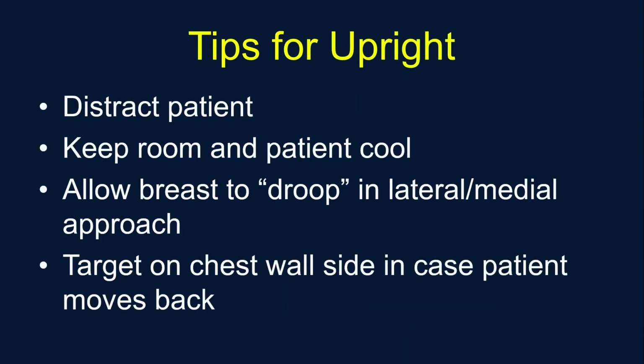Tips for the upright: the most important thing I've found is to distract the patient. Keep them occupied talking about whatever they so desire. Believe me, I've learned a lot about tattoos recently, just very unusual topics that come up in conversation, people's families and all the troubles they're having. Whatever they want to talk about, you show interest so that they're distracted.